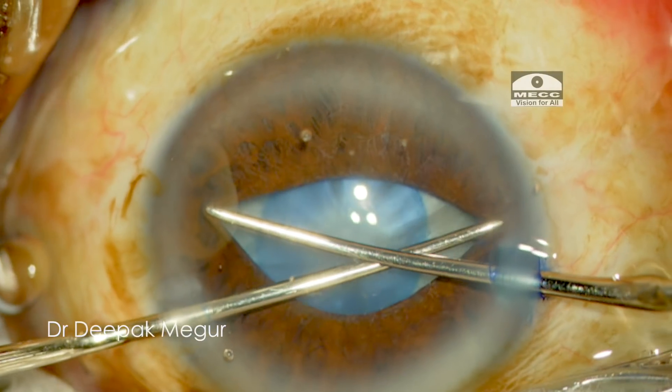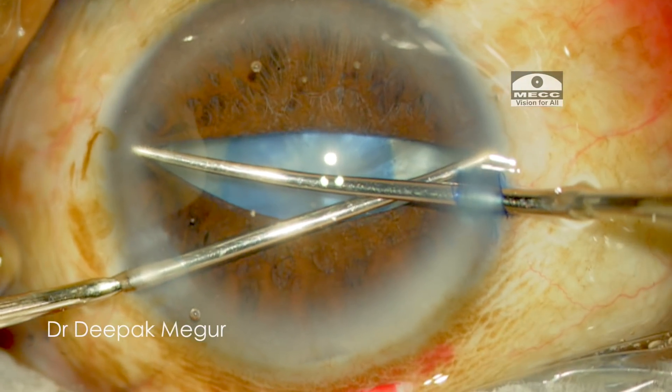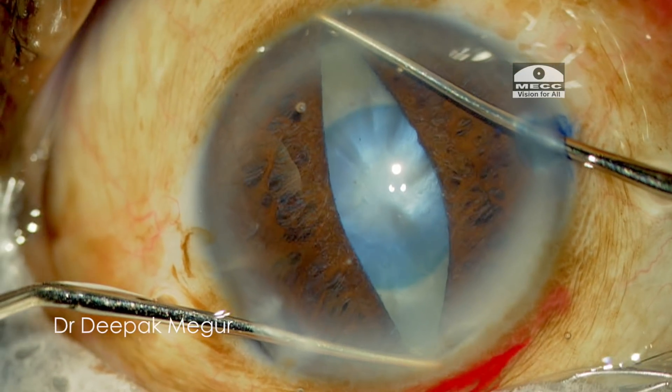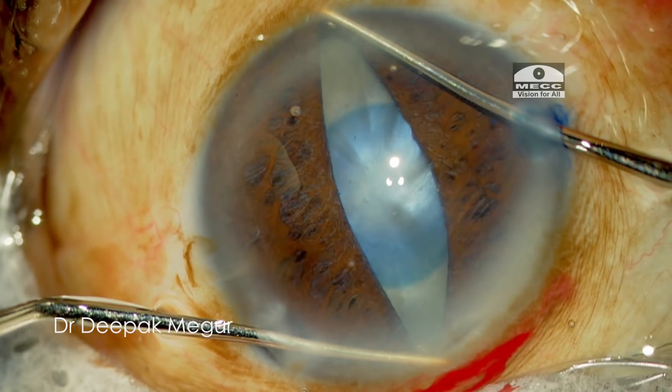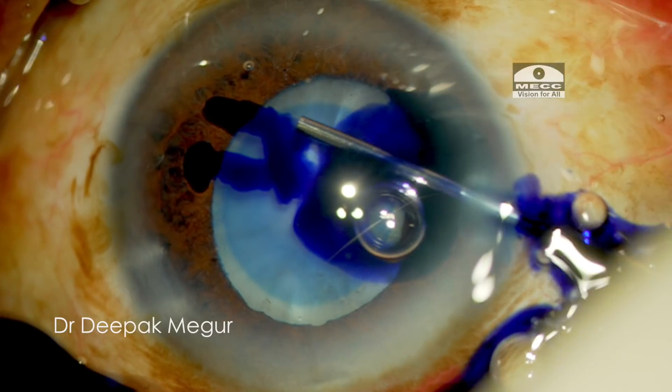The two hooks engage the pupillary margin and they are moved away in diagonally opposite directions towards the periphery. This will result in micro-sphincterotomies, which are responsible for the eventual pupillary expansion.